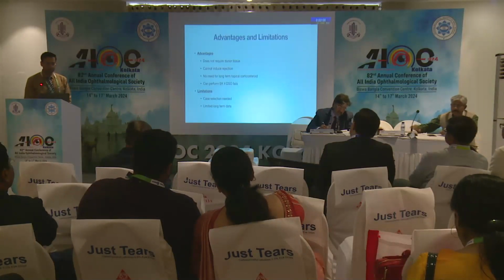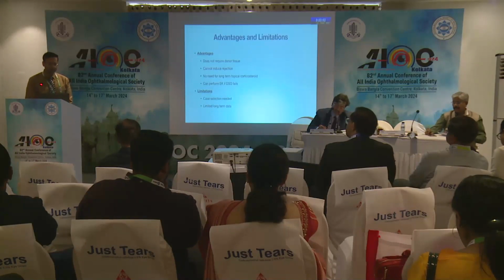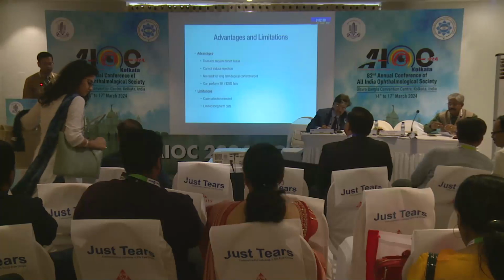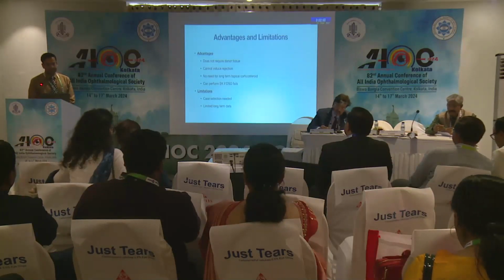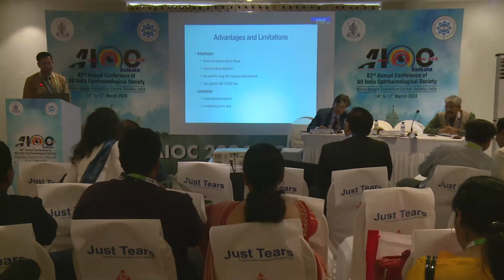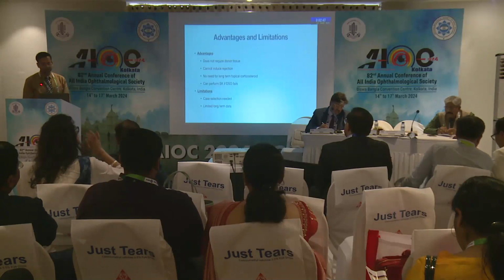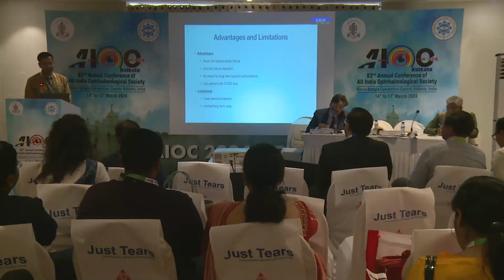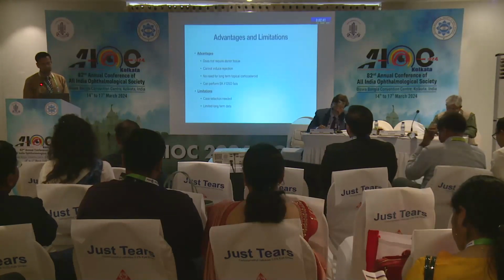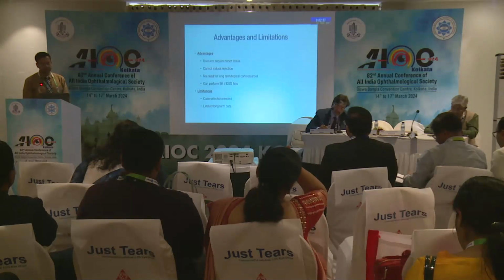So coming to the advantages and limitations of the surgery. The advantages include that it does not require any donor tissue, thereby reducing the dependency on graft and reducing the complications. It cannot induce any rejection. There is no need for long-term topical steroid, and we can always perform EK if the DSO fails. Limitations include that we need to have good case selection, and there is limited long-term data available, so more studies are required to establish the procedure.